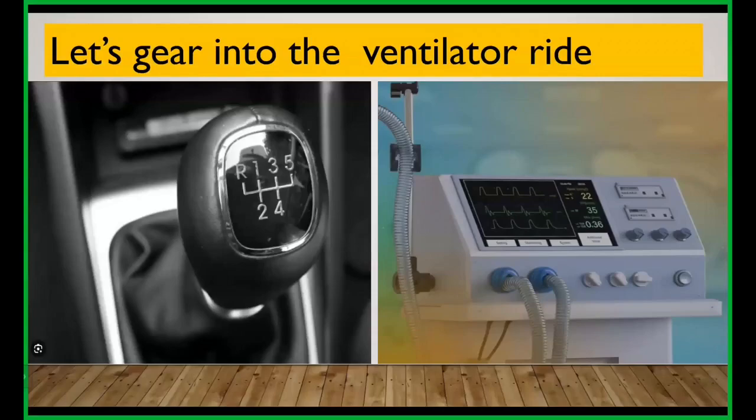So next, coming to the destination. You want to park the car or extubate the patient. For parking the car, not every parking needs a reverse gear. You can park straight away. But in certain conditions like hemodynamic instability or neurological dilemmas, you can continue to ventilate the patient, which can be compared to your reverse gear. So with this intro, let me get into the ventilator ride.